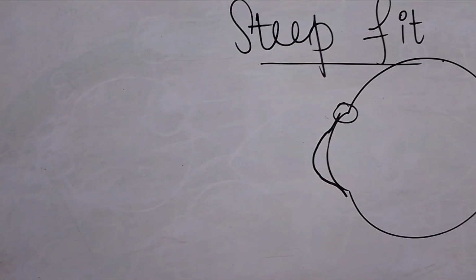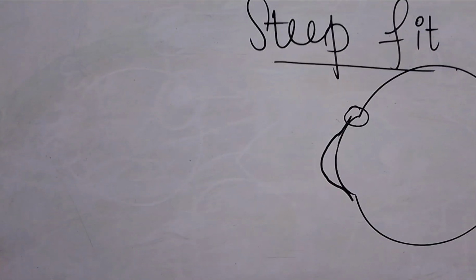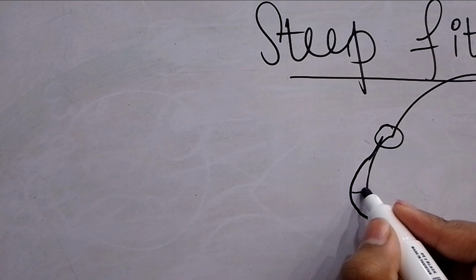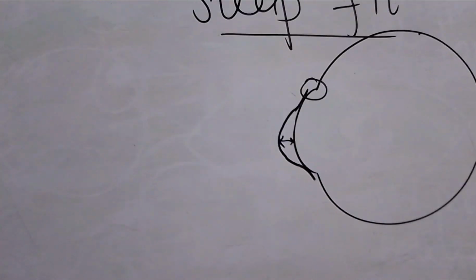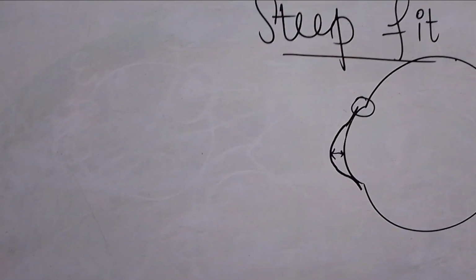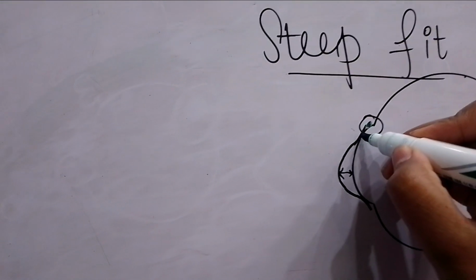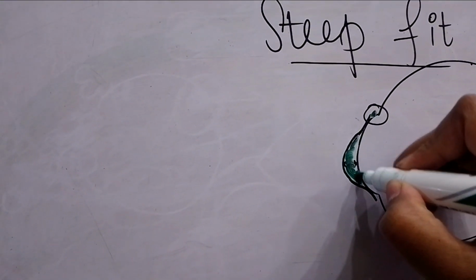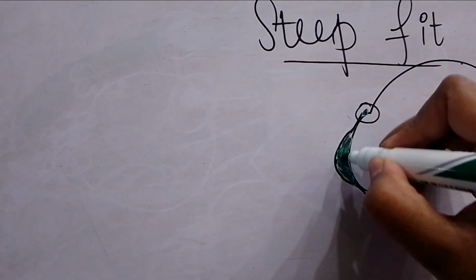There is no edge touch, there is a little mid periphery touch, but the space between cornea and contact lens is more, and it is more curved. It means it is more steeped. So the tears are going to exchange at this edge, right? They will come in this area, and the whole of the center is now pooled, right?